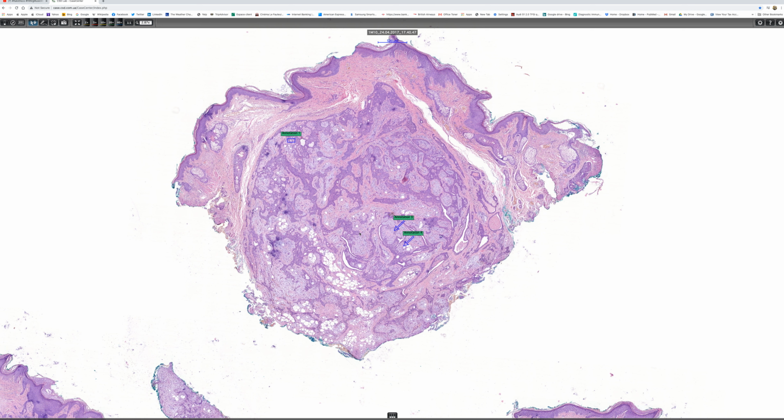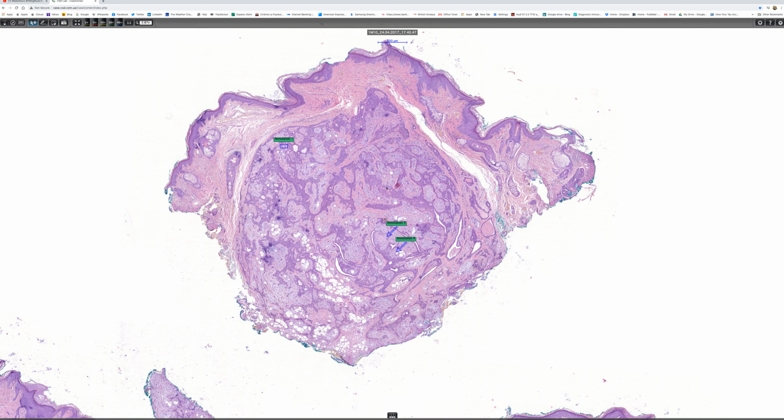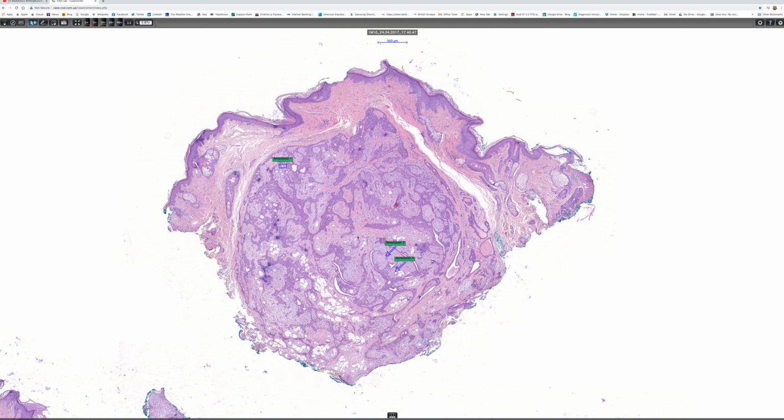What matters, I suppose, is recognition of a tumor as being a mixed tumor and making sure that there's no evidence of any carcinoma anywhere. Now, these are fairly commonly encountered tumors, and most of them occur on the head and neck region, although you may get them elsewhere, obviously, and they present as variably sized firm nodules in the dermis or subcutaneous fat.